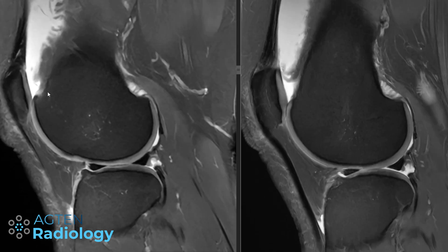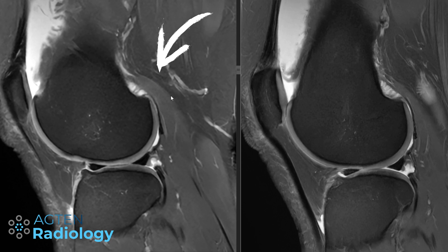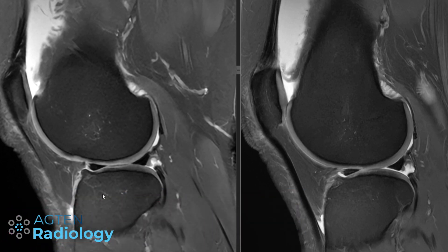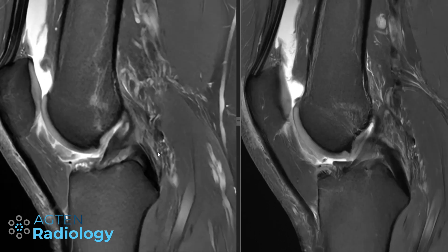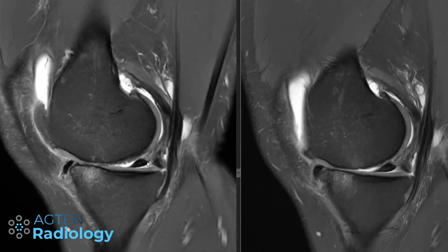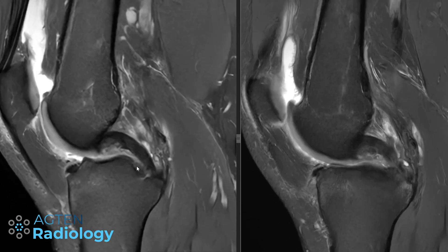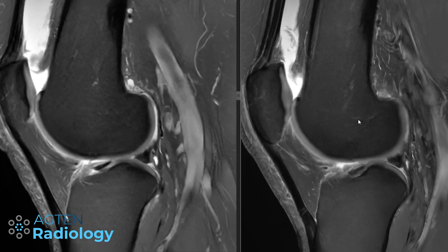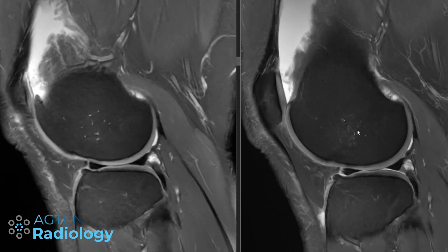It's actually this one. This sequence is part of our 5-minute knee MRI protocol that we use in emergencies or if we are running delayed in the program. You can see this is a fully diagnostic sequence — we can scan the knee in about 4 minutes and 45 seconds. This other one is the standard protocol which takes over 10 minutes to acquire.